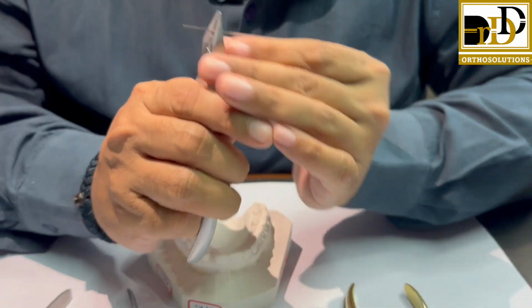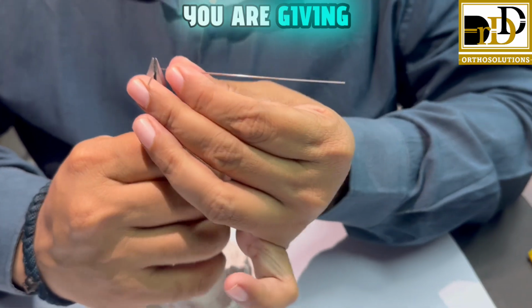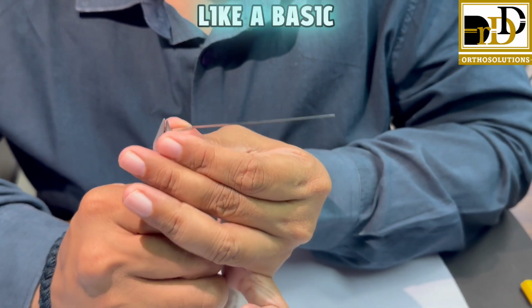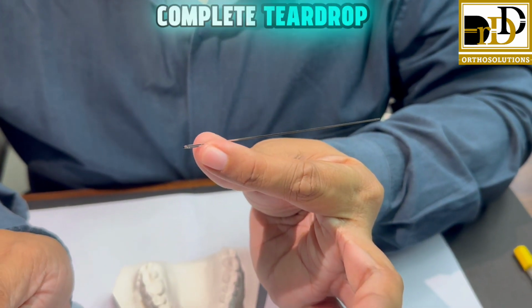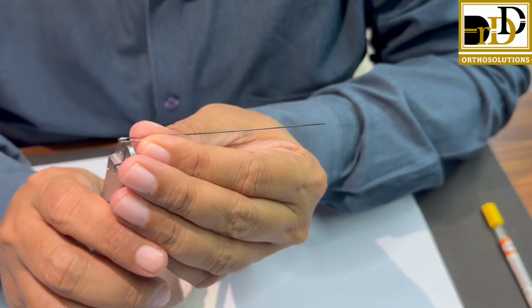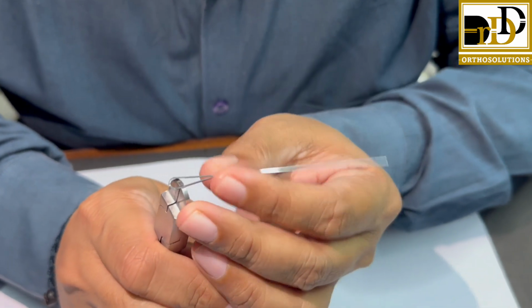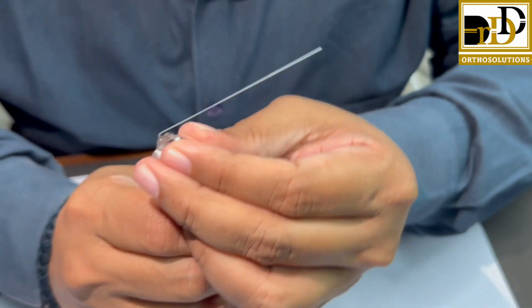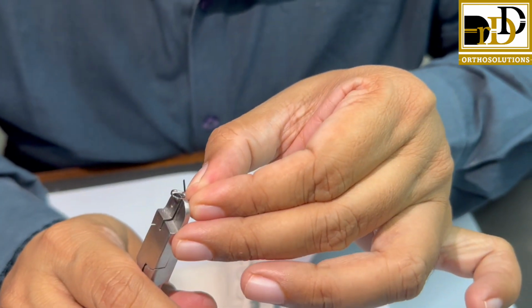In this, by using the bird beak plier, we are giving a basic complete teardrop type of bend, and after that giving another bend.